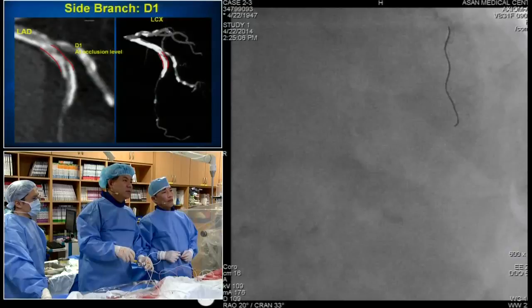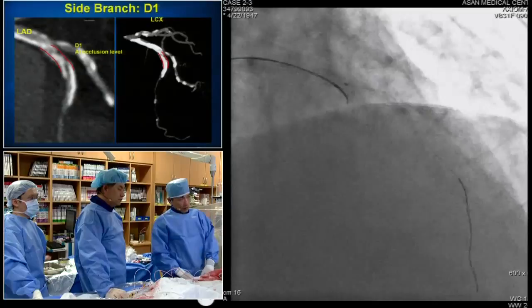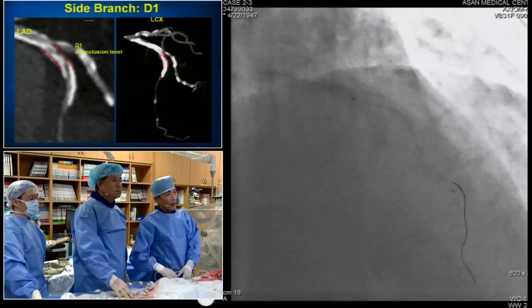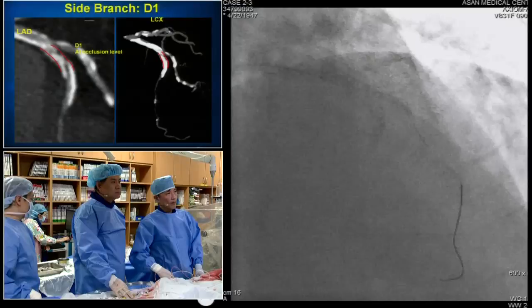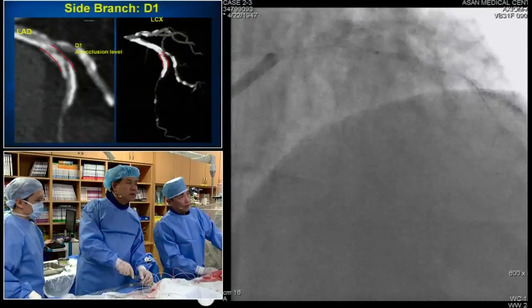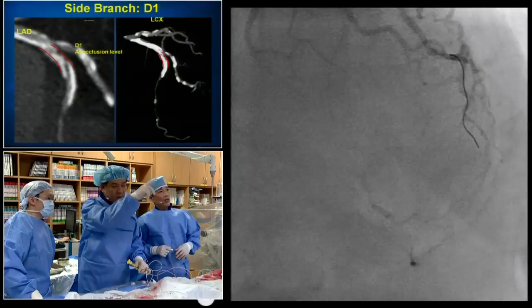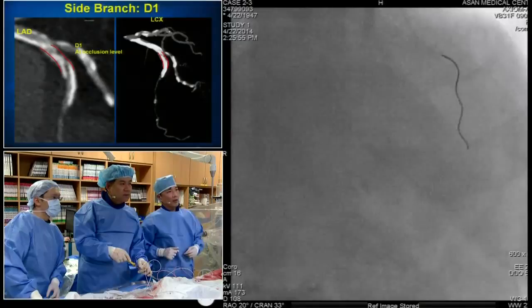Depending on the previous mapping, you can try the upper or the lower portion, the down or the upper branch. Okay, so we draw the course here. Test. Guiding is in? Yes, guiding is up. Check okay. Picture again. Ready? Outer side deflection. Capture and save. Much better. Stop. Clear identification is very important.